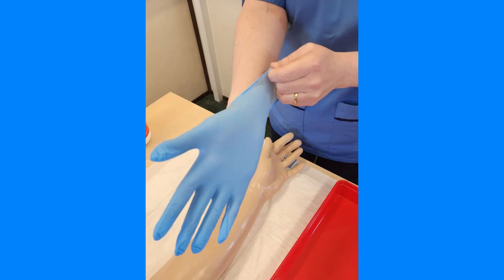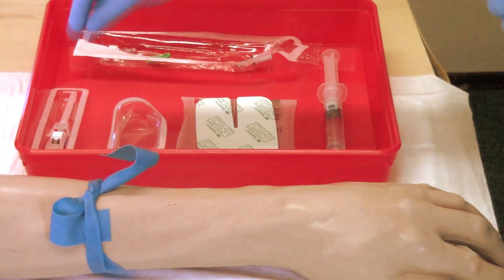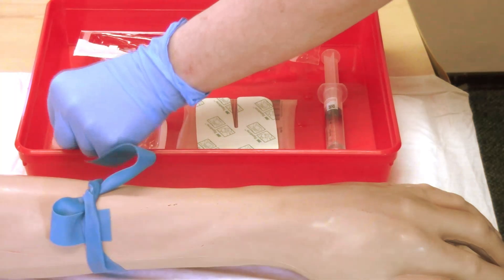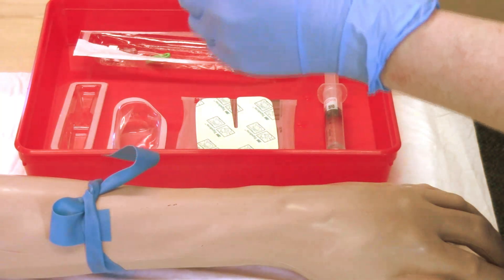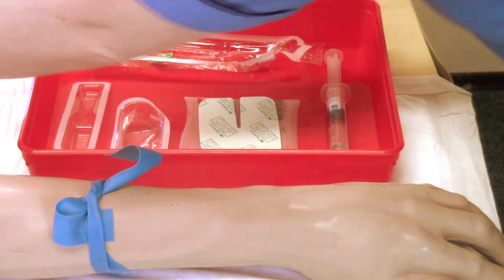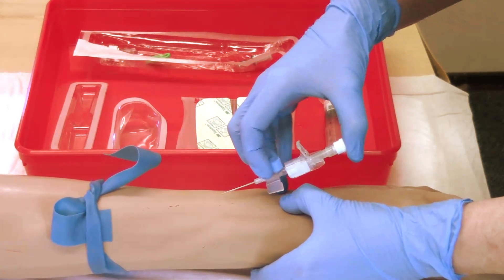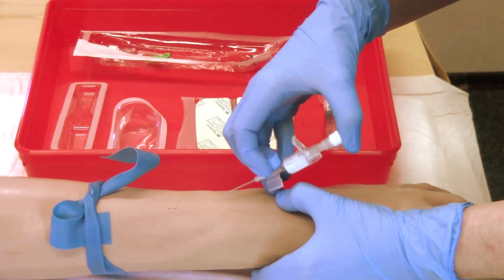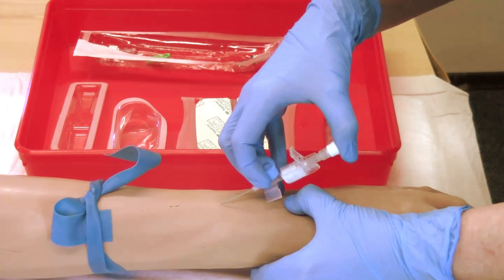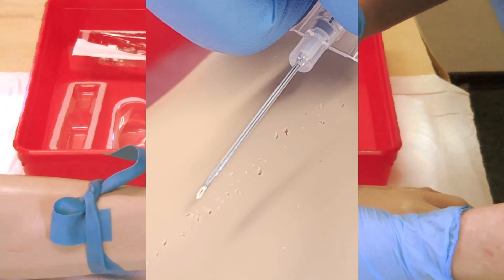Apply non-sterile gloves. Remove needle guard and inspect device for any faults. Anchor the vein with your non-dominant hand using skin traction. Holding the cannula in your dominant hand, place the cannula directly over the vein.